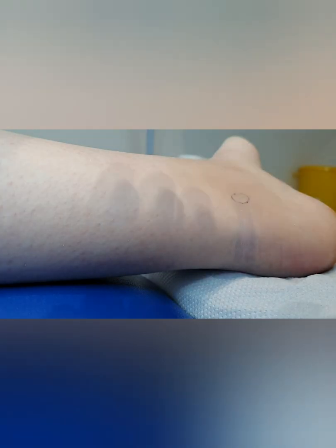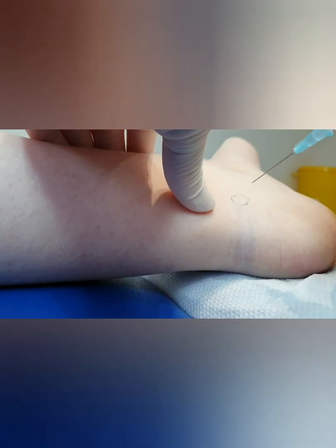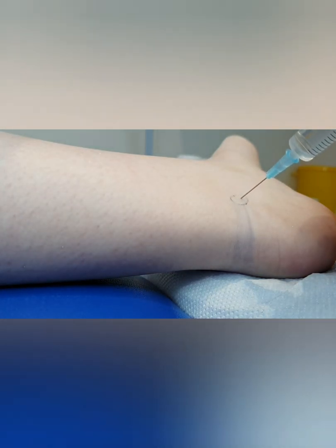So this lady's come for verruca needling, which is a way of getting rid of verrucas, and it requires a local anaesthetic. This particular local anaesthetic is what we call a tibial block. So we're going at the inside of the ankle here. That little circle is just to make sure that I'm in the right spot.